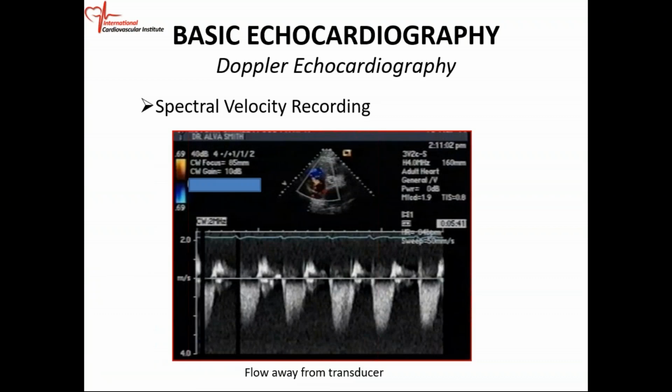All right. So this is an actual study. This is the short axis at the level of the aorta. This is our probe. When you have these studies, you always have to see what is going on. This symbol represents your ultrasound probe or transducer, which is on the patient's chest.